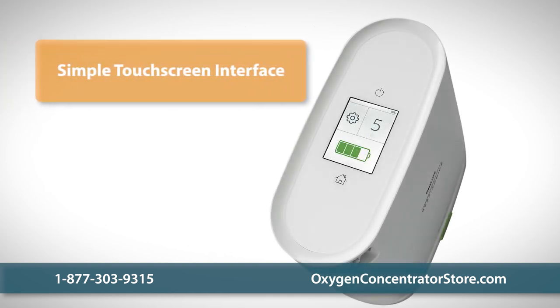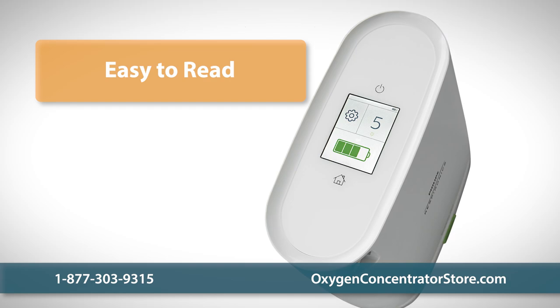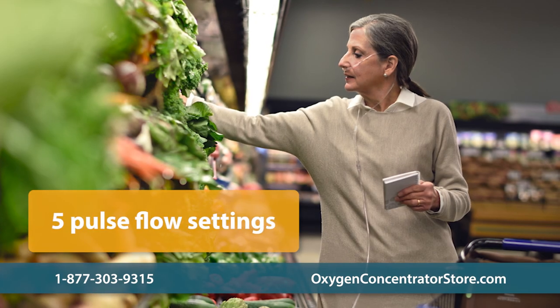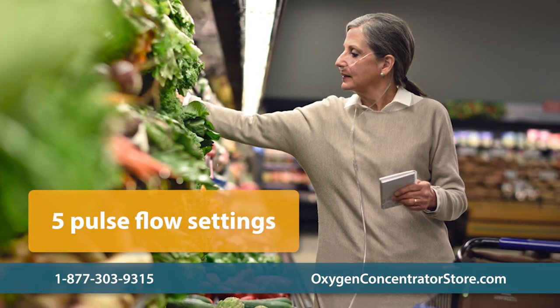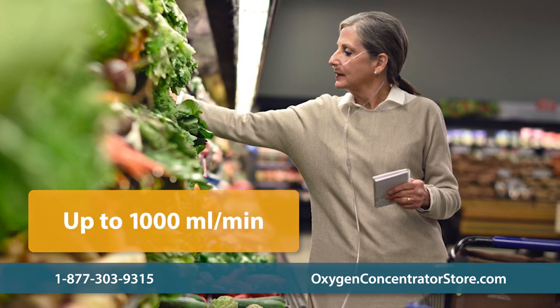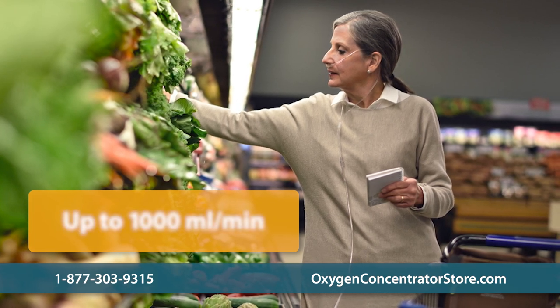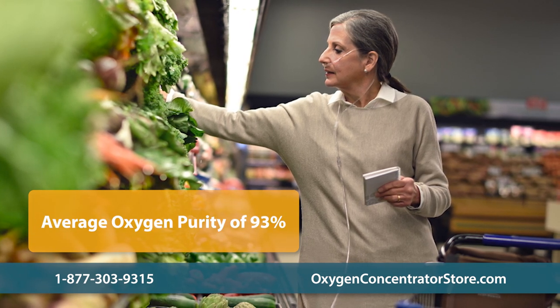The large, easy-to-use and easy-to-read LCD touchscreen makes it simple to adjust your settings on the go. The Mini features five pulse flow settings for total control, providing 220 milliliters per minute on its lowest setting and 1,000 milliliters per minute on the highest. The oxygen purity averages around 93 percent.